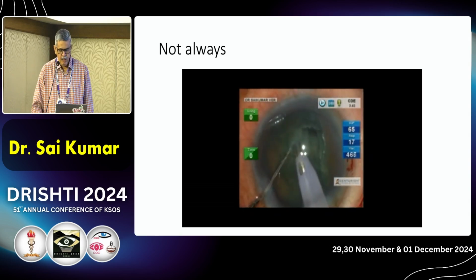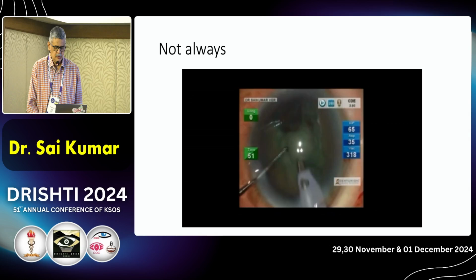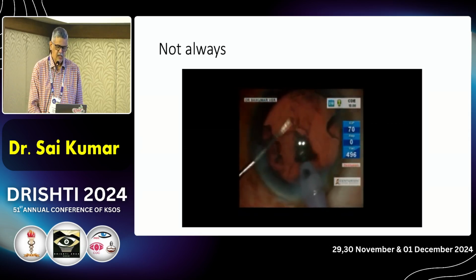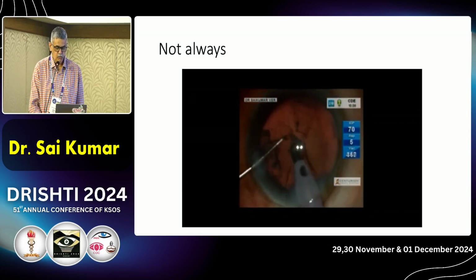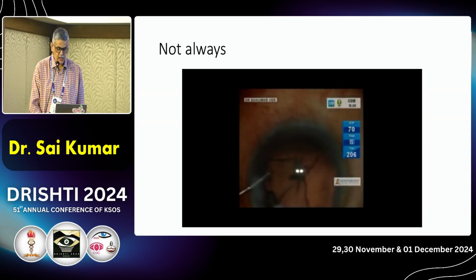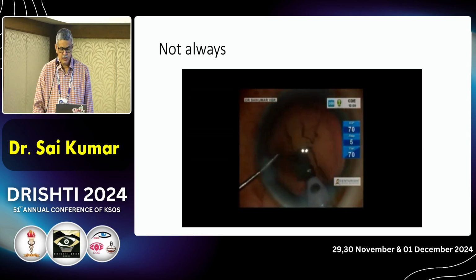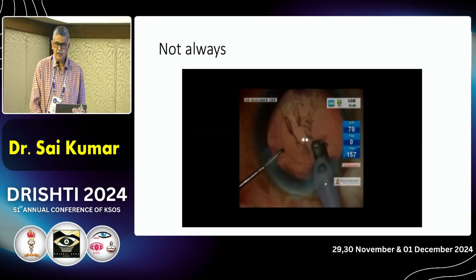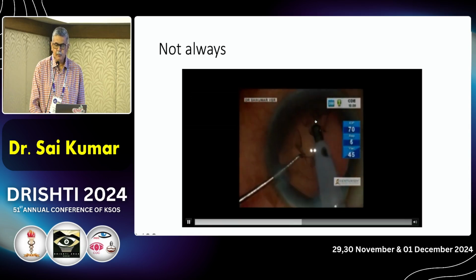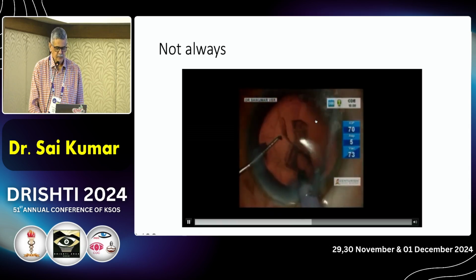And then without any rotation, I chop small pieces and then mechanically move the nucleus into the center, into the phaco probe from various sides and finish it. But as I am finishing here, doing my coaxial irrigation aspiration, I find that there is a PC rent. So this is the typical, like Dr. Sandhya showed, the typical PC rent that you get in a PPC, a long linear PC rent.